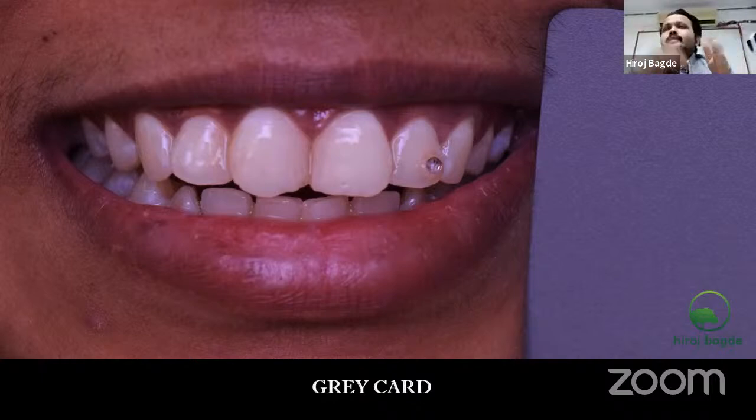So I need something to be standardized. For labs, I prefer to have an image guide using a gray card, which is 18% neutral gray along with white inside it. Why am I telling you this? Because this gives good exposure triangle settings.